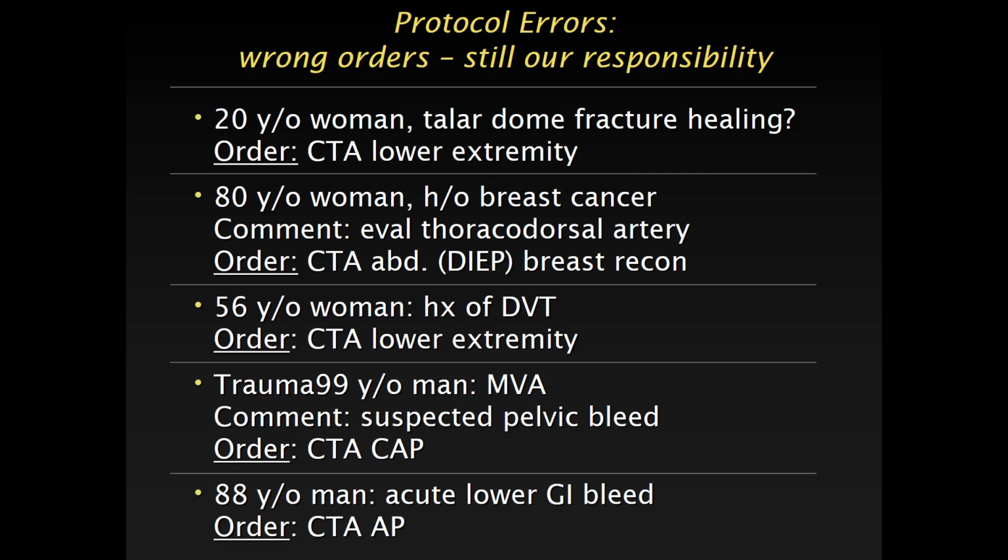Right? So this might have been a high-resolution bone scan for the MSK guys, but whoever protocoled it didn't pay a lot of attention and just clicked the CTA runoff protocol. And now you have a non-contrast abdomen pelvis, a CT angio through everything, and a delay through the lower legs for a talar dome fracture. So again, these things can happen, but they shouldn't happen.